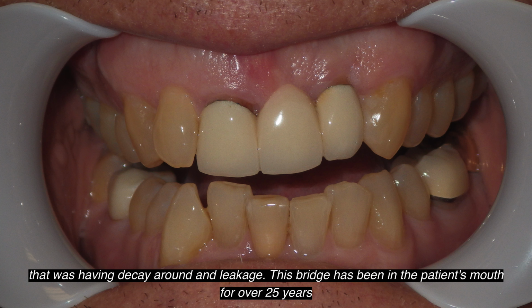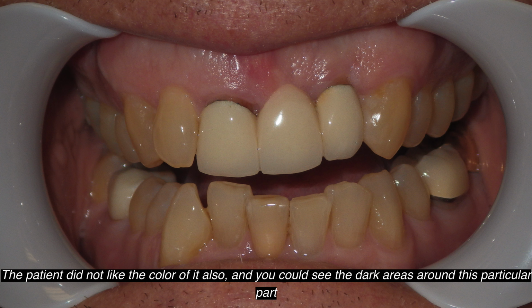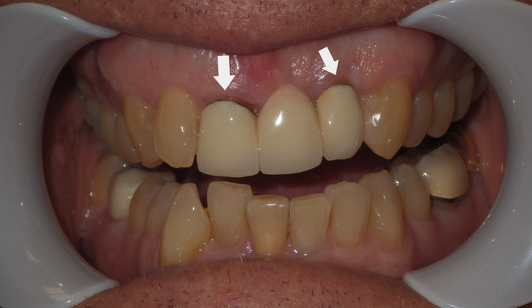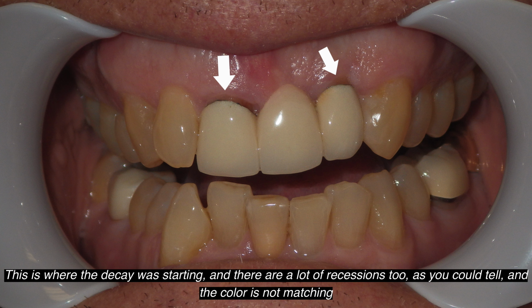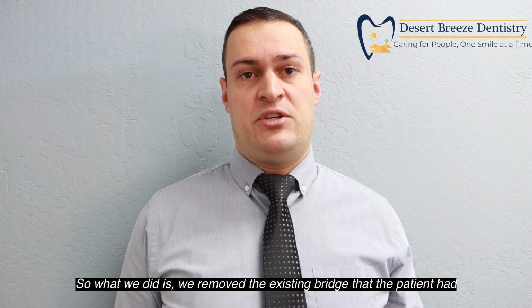So in this particular case that we're going to be discussing, the patient had an older bridge that was having decay around it and leakage. So this bridge has been in the patient's mouth for over 25 years. Patient did not really like the color of it also, and you could see the dark areas around this particular part. This is where the decay was starting, and there's a lot of recession too, as you could tell, and the color is not matching. So what we did is we removed the existing bridge that the patient had.